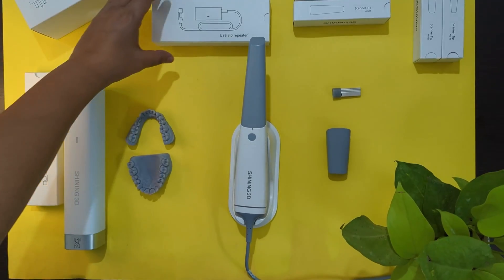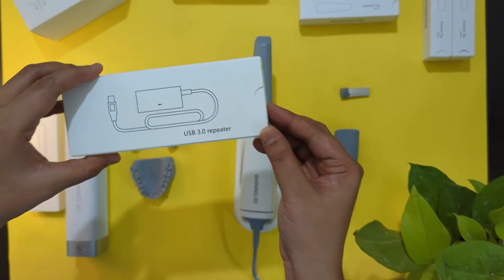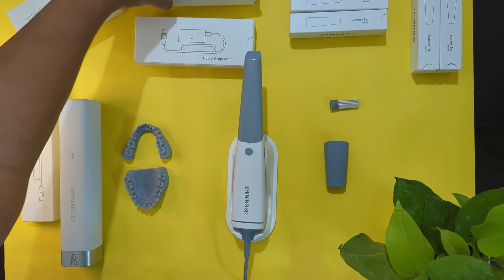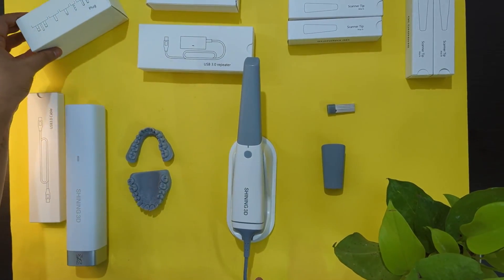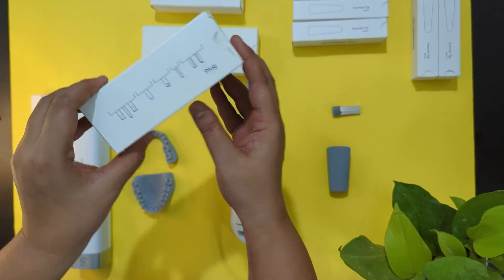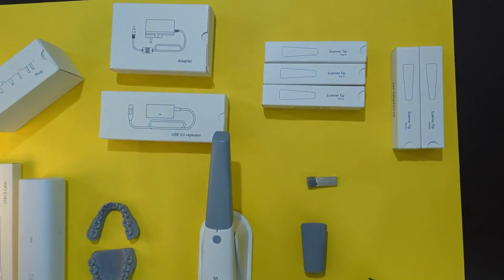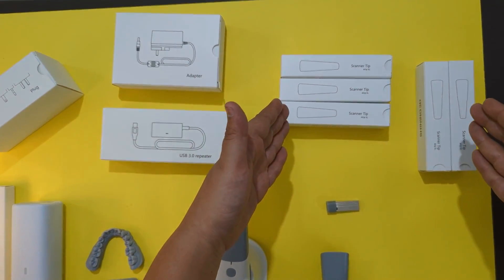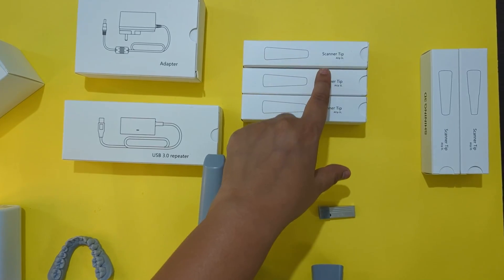There are also certain cables, USB ports, and adapters included along with the intraoral scanner. Depending on different countries and regions, different plug types are provided as well. The scanner tips — three for adult patients and two for pediatric patients — have already been covered.